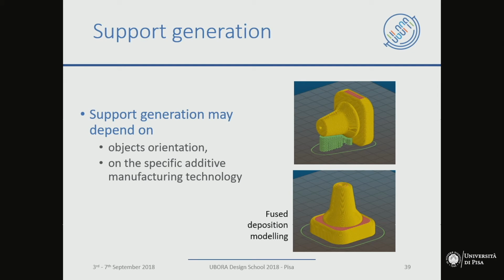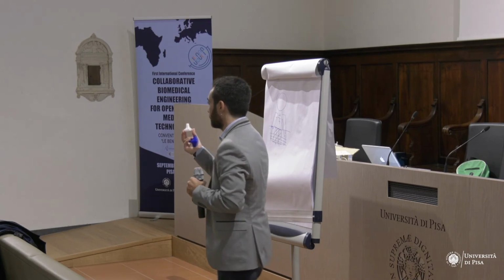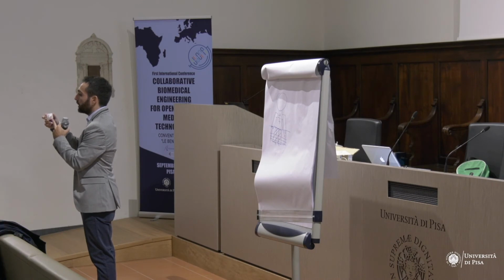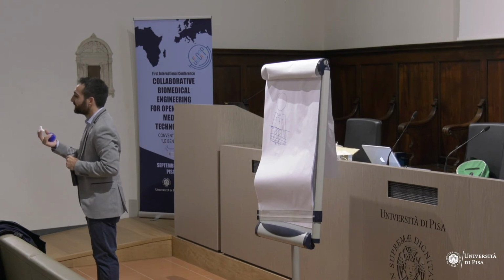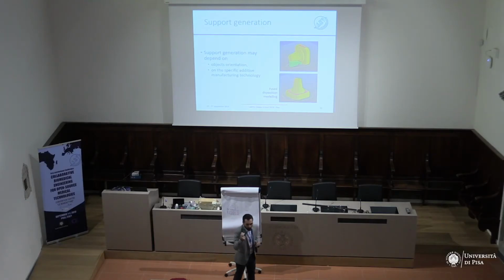But because I prefer that it looks more beautiful, I decided to print in this position. But if you put it in this position, you need support material. And it's not so nice. And you need to finish it. And so I don't want to make a post-process. So the initial shape was not a flat surface, and then I changed the design to print in this position.